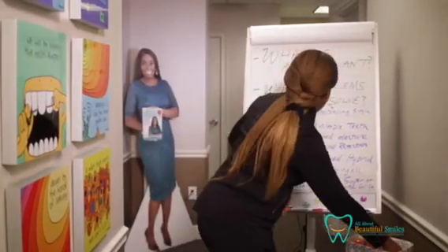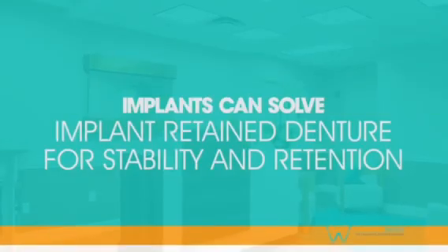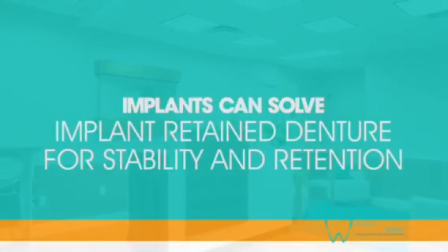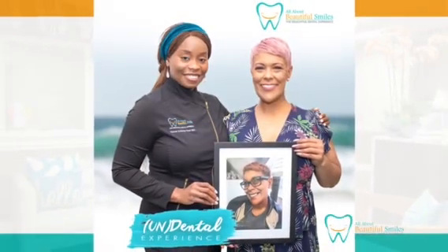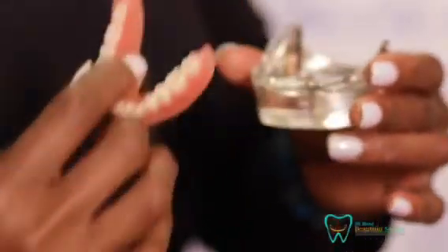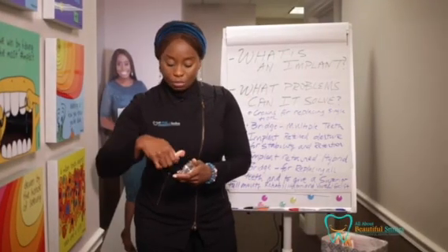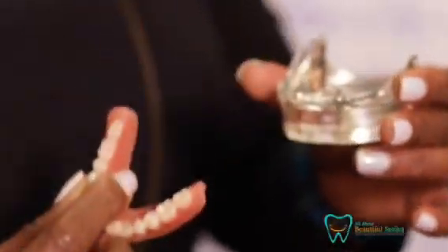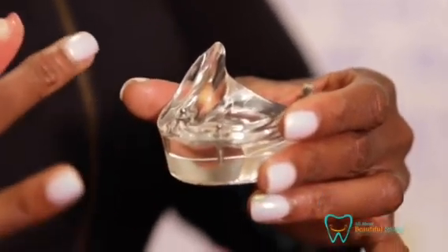All right, then the implant retained denture for stability and retention. I have been so blessed and honored to have helped so many people. So with the implants, we can either put in two implants to help retain the denture. So two implants is not ideal. I never do two implants.